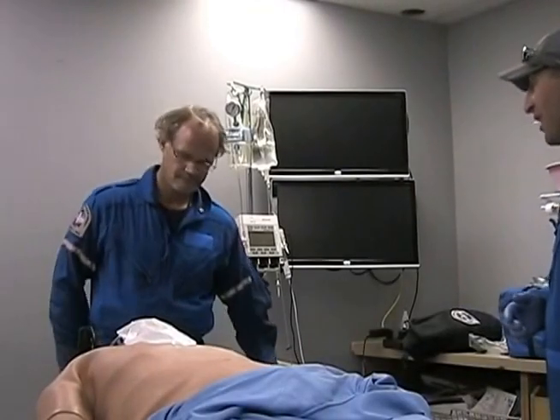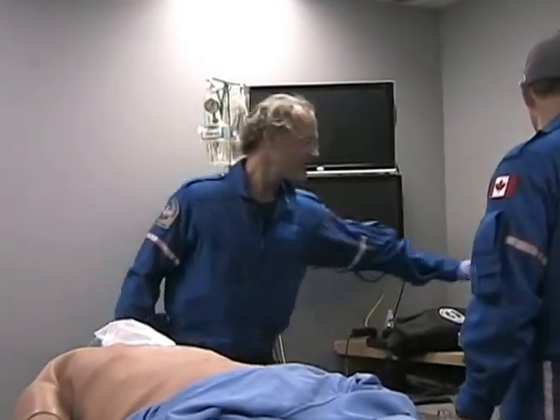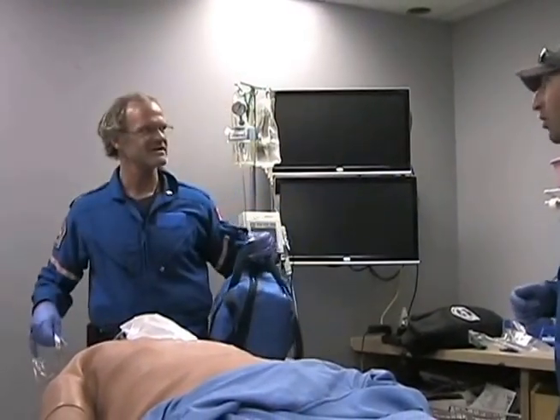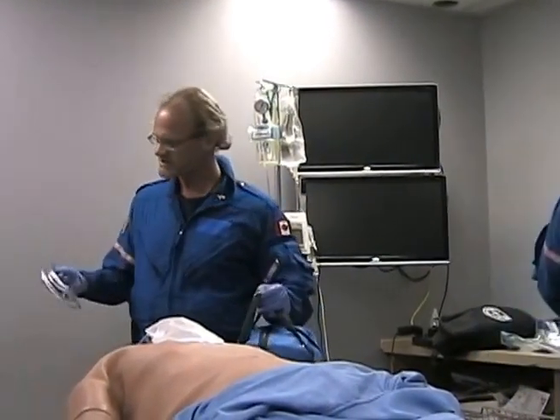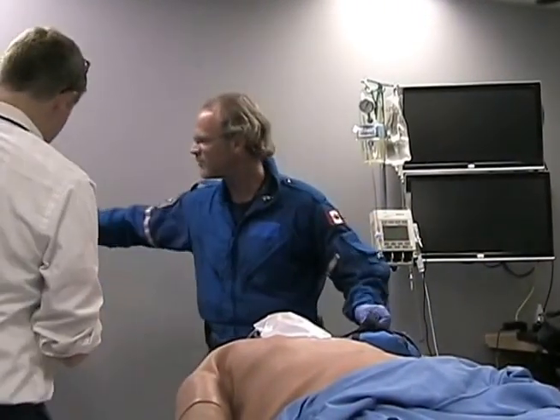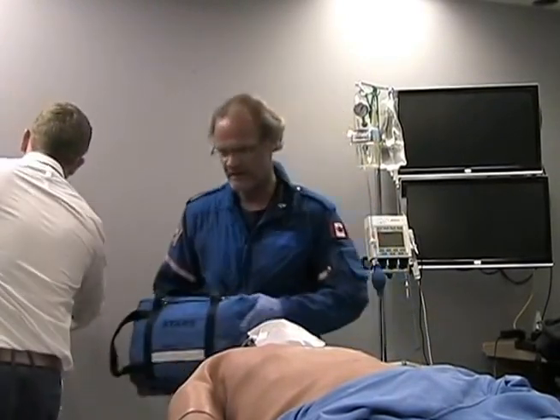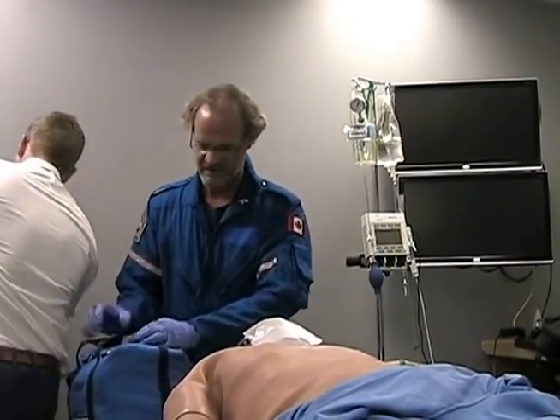So Scotty, it sounds like this guy does need to be intubated. Right. Are you good? I'll draw up some drugs. And maybe you and James, James is actually going to help me here with getting some of the airway stuff. Okay, setup, super. I'm going to draw up some drugs here then. Hey there, James, do you mind putting a nasal cannula on at 15, and we'll put that non-rebreather on at 15, and I'll get you to help me with some of the other things here when we're getting him ready to be intubated. Okay? Awesome. Appreciate that.